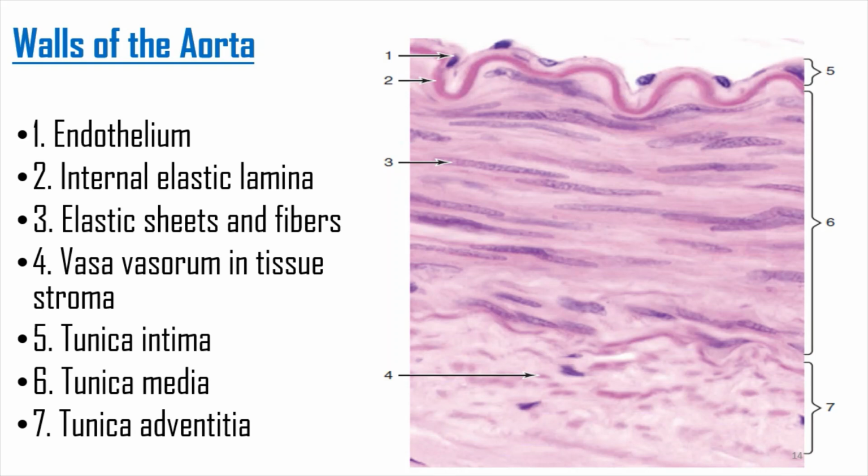So these are just blood vessels. You can just draw them as circular vessels. Number 5 is the tunica intima. So this is the innermost layer. This is the tunica media. And 7 is the tunica externa or the tunica adventitia. So remember, draw the artery and the vein at low power and high power, and then draw one diagram that is showing the endothelium at high power here.